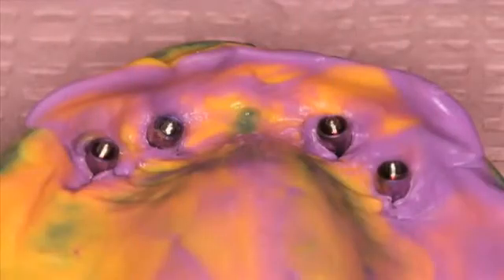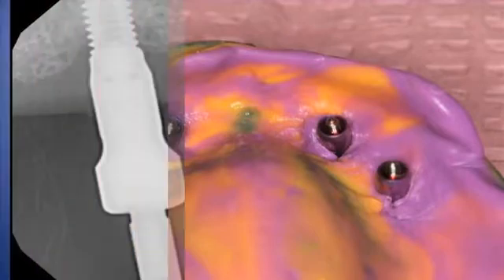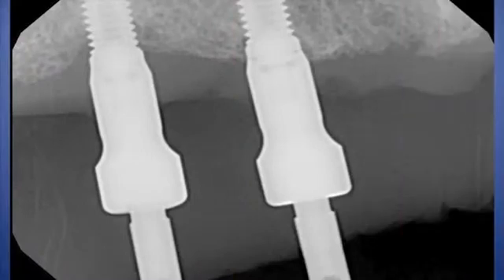Figure 20 shows that following proper integration of the dental implants — which was about four months — a conventional polysiloxane impression was made using impression copings. Radiographs are used to verify complete seating to the top of the implants. Whenever we have metal-to-metal components, it's critical that you take a radiograph to ensure complete seating of your impression copings. Figure 21 shows an accurate impression made using the indirect technique, exhibiting no voids or distortions.